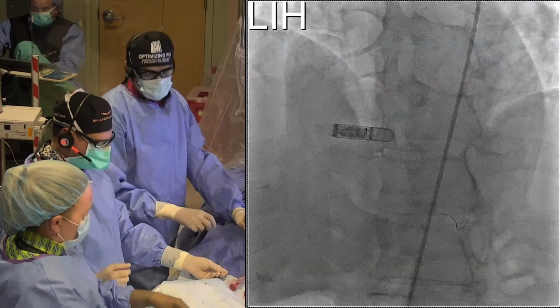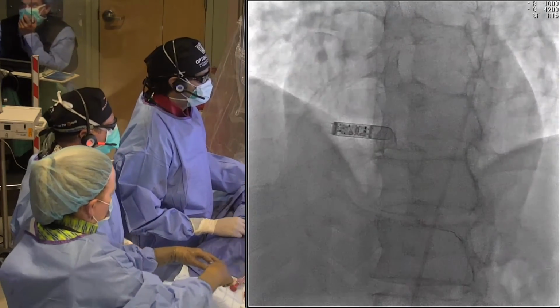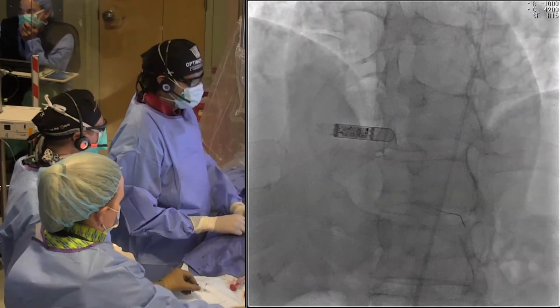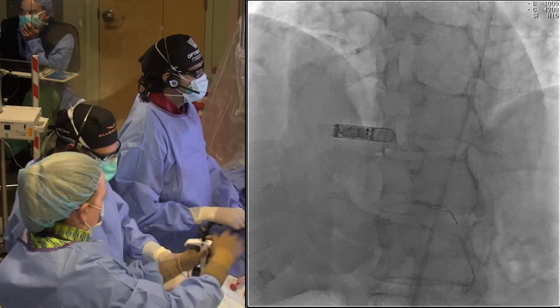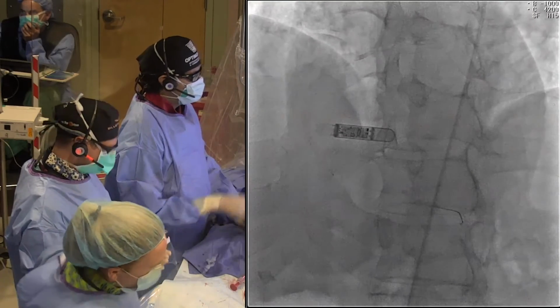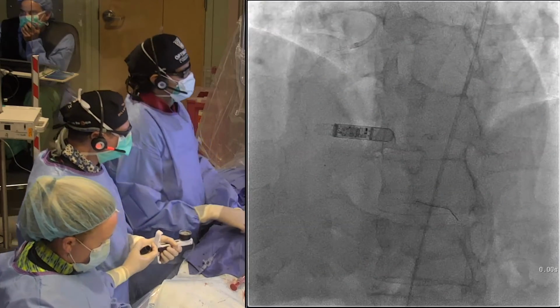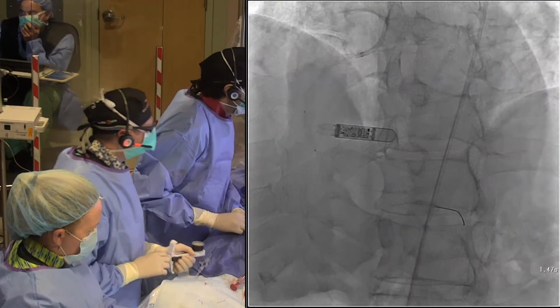I really was just thinking how this is a very good wire. It's a very good wire, even for a regular wire. Taking that bend without reshaping it, and then look at the delivery. It delivers really well. I mean, okay, it's not the calcified angle of the case, but still, it's pretty nice.